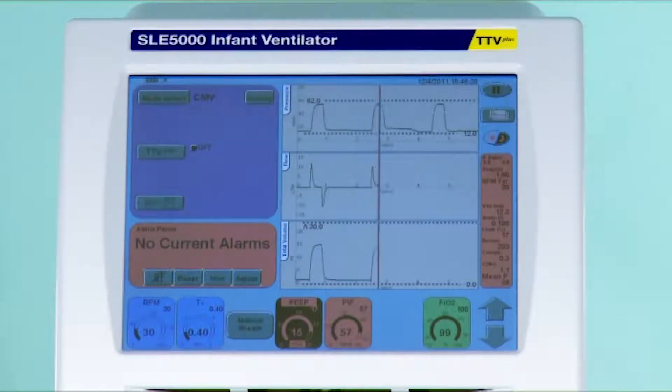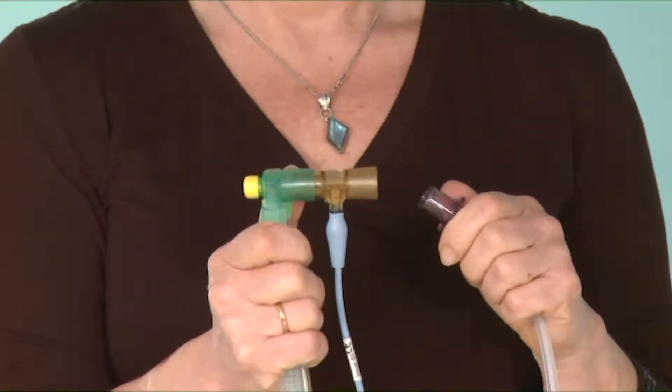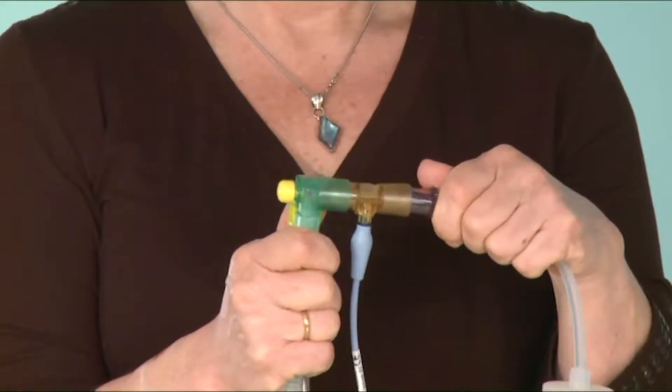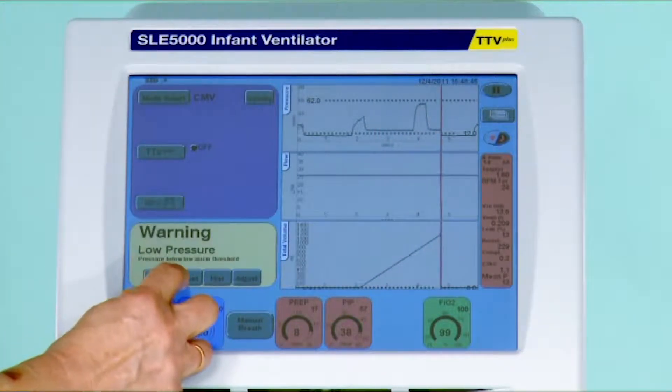Often when you need to suction the baby or something has happened, you disconnect the flow sensor from the ET tube and you might leave it lying in the bed whilst you suction or do whatever needs doing. When you go to reconnect your baby and you cancel the current alarm, you get the message reset contamination alarm.